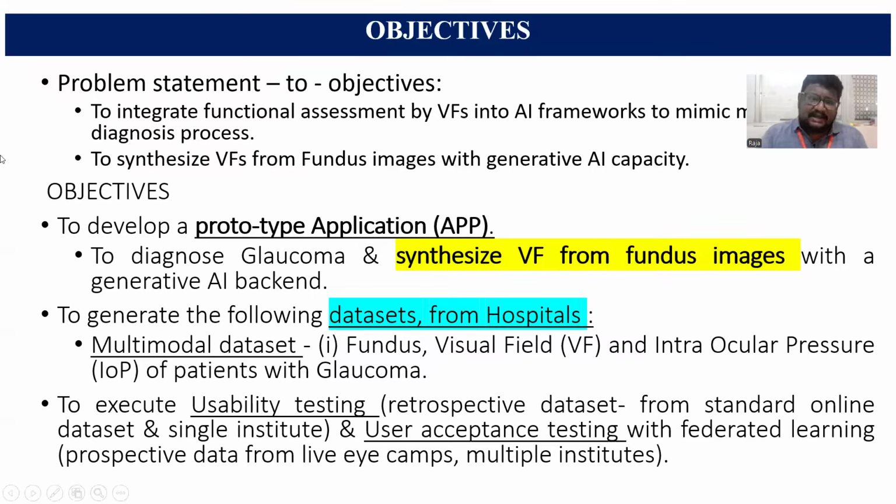process. The second objective, which is the main objective, is to synthesize visual fields from fundus images with generative AI capacity. That is what we are mainly going to do in this hackathon. We are going to synthesize the visual field values from fundus images.